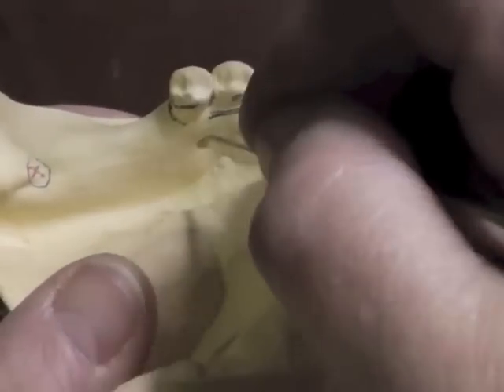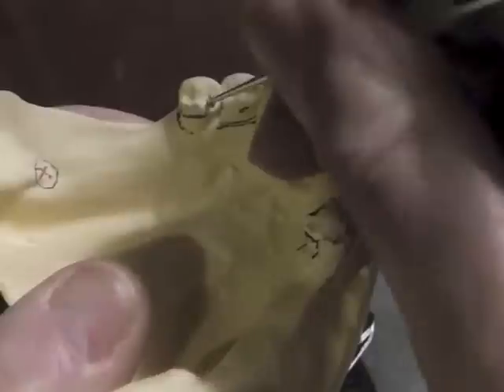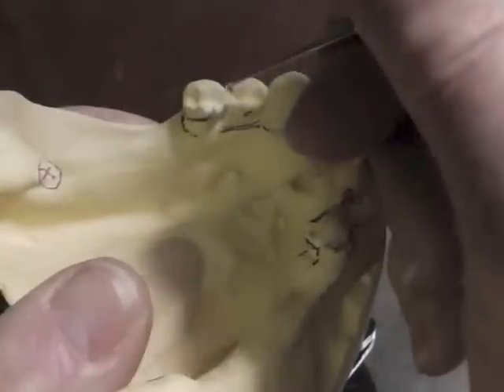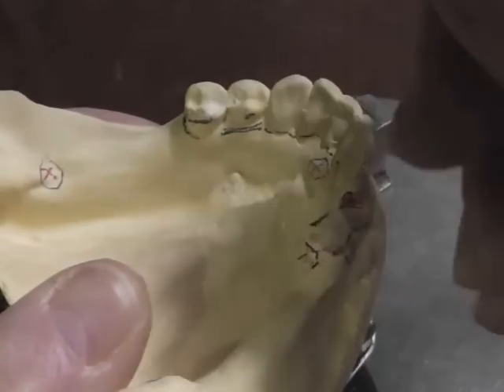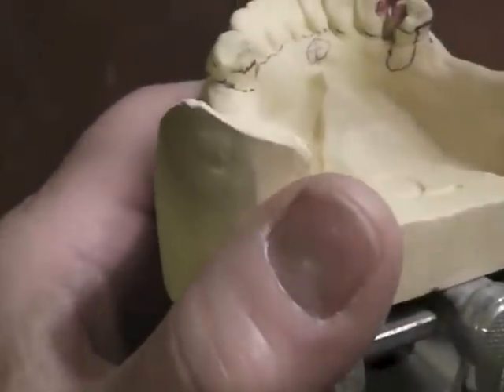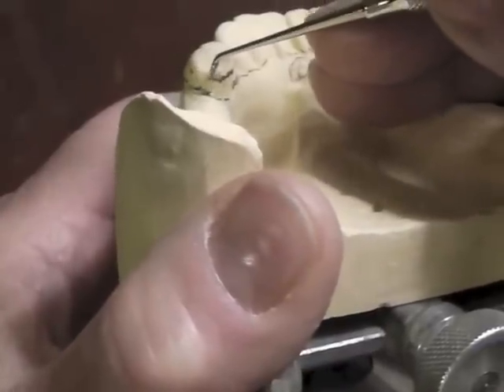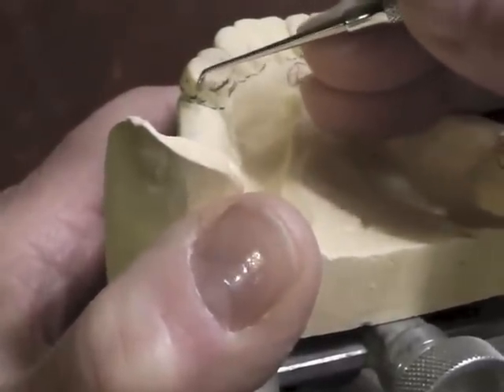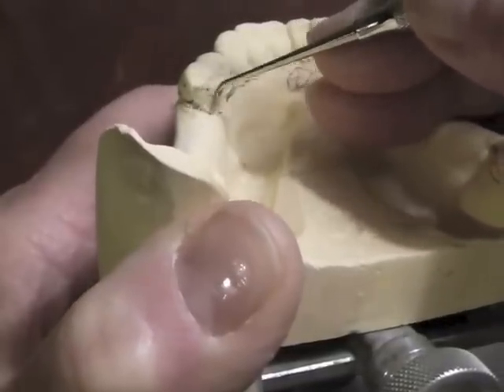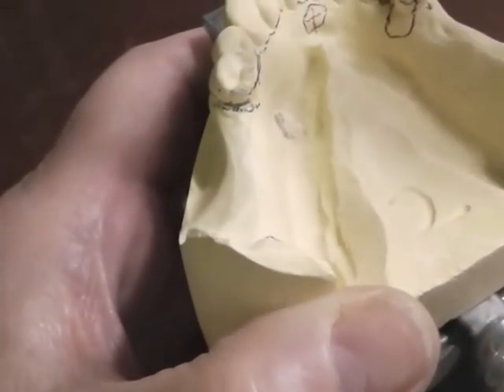We take a sluice way through here — I already prepared that when I did the marginal ridge. We have a sluice way in that area, but we don't take the sluice way through the buccal surface because there's no arm going through that buccal area, so we would not prepare a sluice way there. I have a nice positive seat here. My marginal ridge and guiding plane look pretty good. I have a little bit of a high survey line, so I'm going to go ahead and lower it — really just a fraction of a millimeter — prepare my guide plane, and resurvey. I've now moved my survey line down to the gingival aspect.